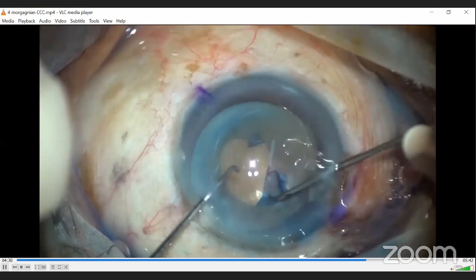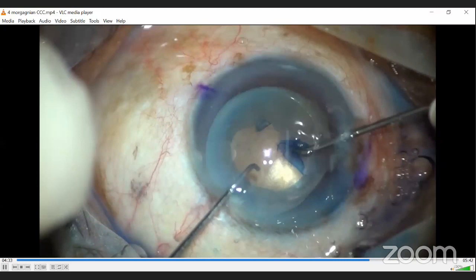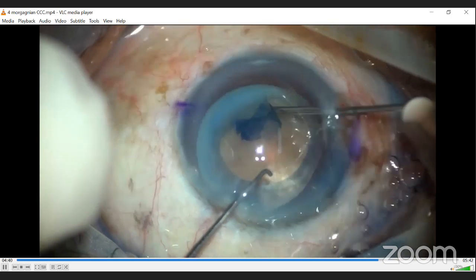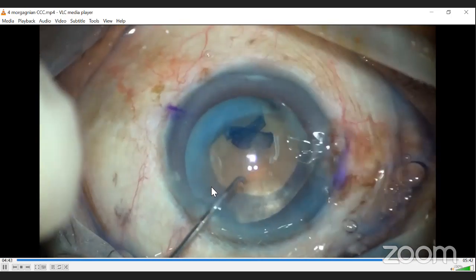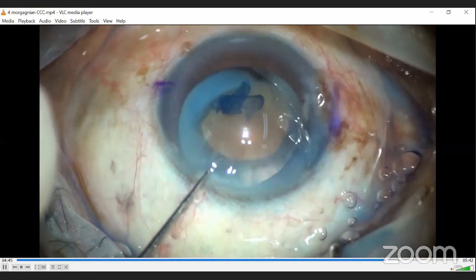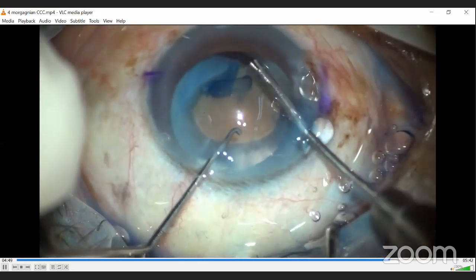So I continued with cystitome because I thought that, yeah, in this case I can do it. But now watch here. It just extends. Can somebody tell me why it extended? You can see the nucleus has moved to one side, and obviously there is no support for the rhexis using cystitome there, so it went out. So that's why I think for Morgagnian cataracts, it is better to use capsulorhexis forceps.